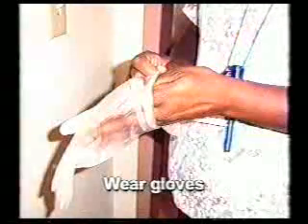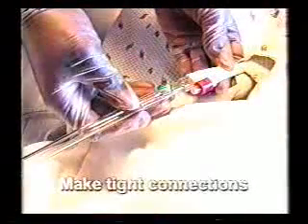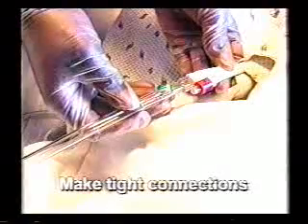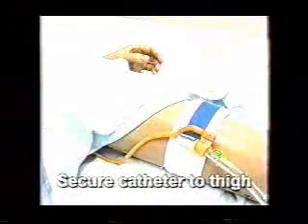You must apply gloves before handling a catheter, making sure that all connections are tight to prevent leakage from the catheter and prevent germs from entering the drainage system. Remember never to disconnect the urinary tubing from the catheter without permission from the nurse. Catheter leg straps should be used to prevent pulling on the bladder.